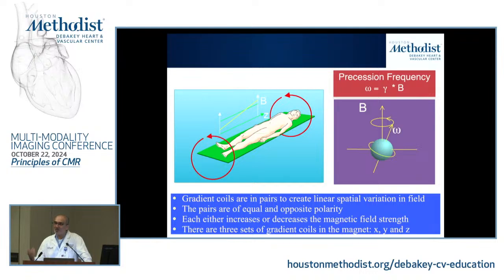And the reason the scanner is able to select that slice of interest is, again, by this concept of when you apply a gradient, which is the first step we talked about, you put the patient into a magnet where the body tissue is facing a certain magnetic field. Applying a gradient in this head to foot direction will cause the protons further away from your center to be spinning slightly faster, because the magnetization is a little bit higher as you go further up, right? That's what this line right here represents. And on the bottom side, as you go further down towards the feet, the magnetization is a little bit lower and lower, and therefore the precession frequency will be a little bit less and less.